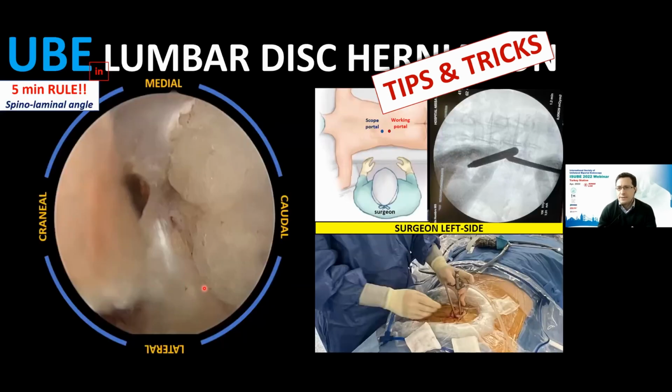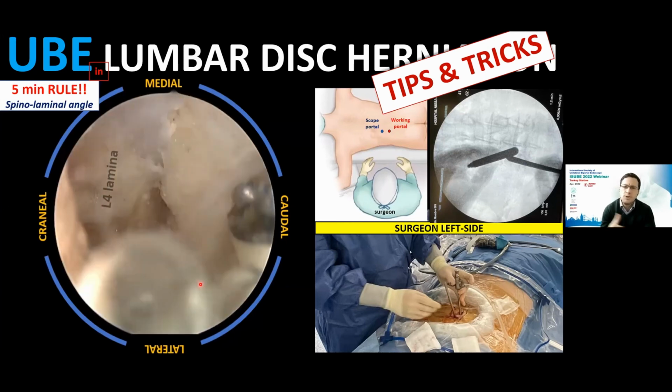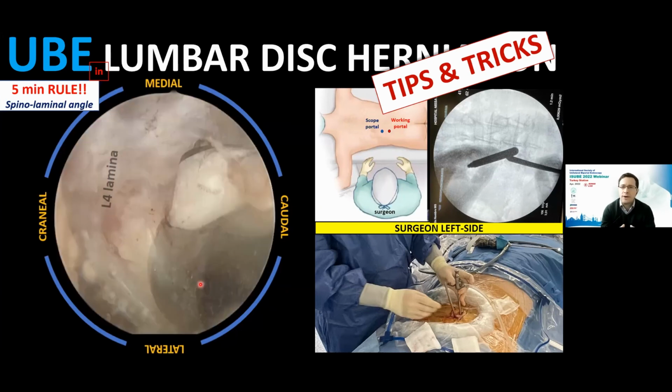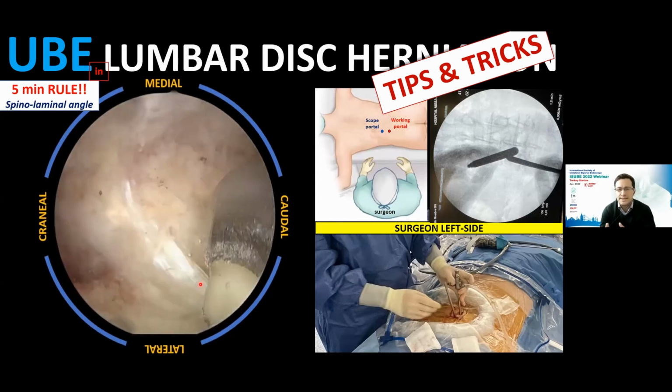We call this tip the 5-minute rule. You should spend no more than 5 minutes to find your spinolaminar angle. If you spend more than 5 minutes to understand where your spinolaminar angle is, you are losing your time. Something is wrong. Stop your surgery, put your C-arm in again, and try to understand what happened with your triangulation. So you only need 5 minutes to find the spinolaminar angle, and after that you can remove the soft tissue that is in the interlaminar space on the multifidus fascia. So no more than 5 minutes.